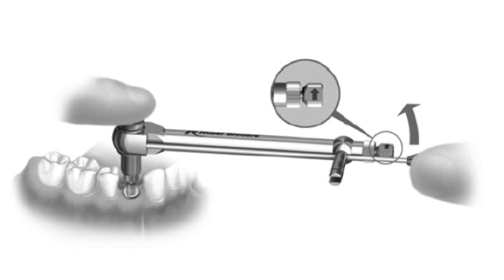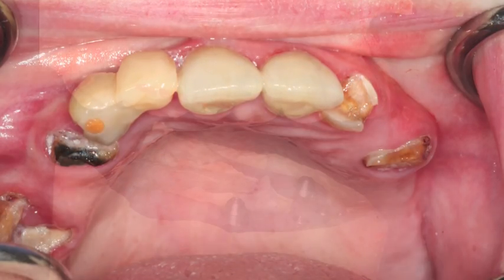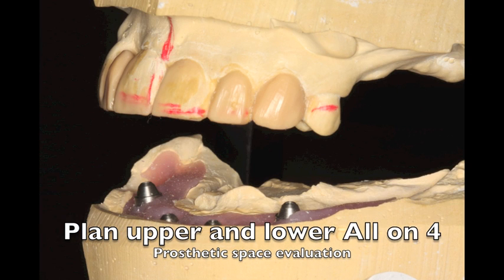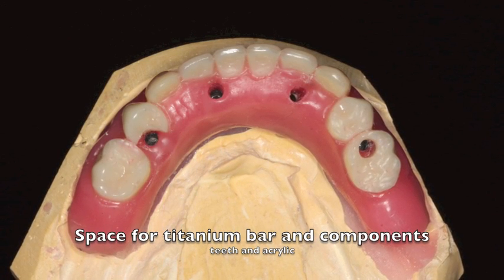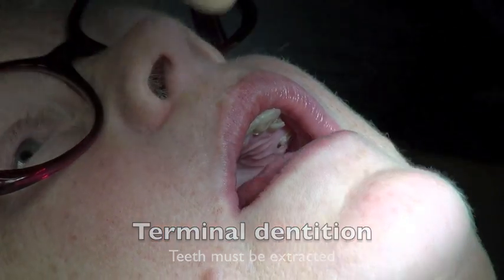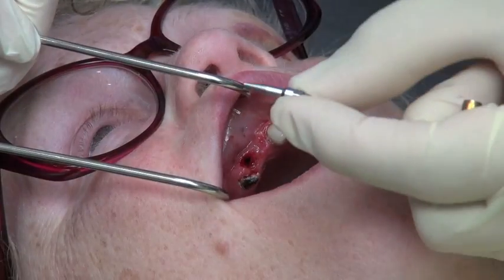Once you put this into the implant and reverse, you will take the implant out. Today's patient is a candidate for an all-on-four upper and lower. We have a temporary crown system on the implant now just so we can get it off quickly. The upper is planned to have 15 millimeters of prosthetic space, and the lower also has 15 millimeters of prosthetic space. This space is used for both upper and lower arches so that titanium bars can be made and all components can fit in and have structural strength. If you're going to do an all-on-four, it may be necessary to remove some single implants and place implants higher so that you'll have the prosthetic space required to finish the case.